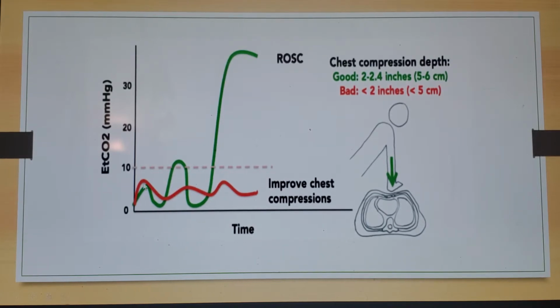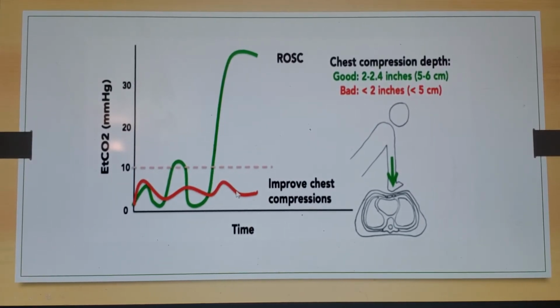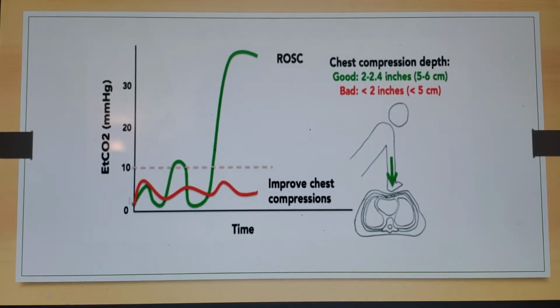So they're doing wimpy CPR. So you need to look and see if it's something with the patient's body habitus that can't be helped, or if the provider needs to do more depth with their compressions or more rapid compressions. The second one shows what happens in ROSC.